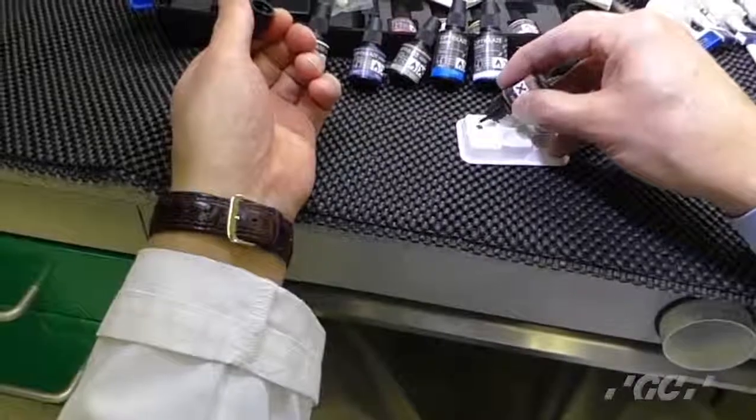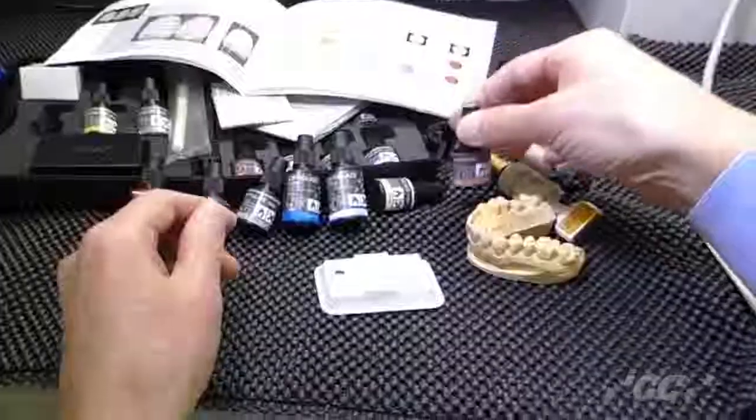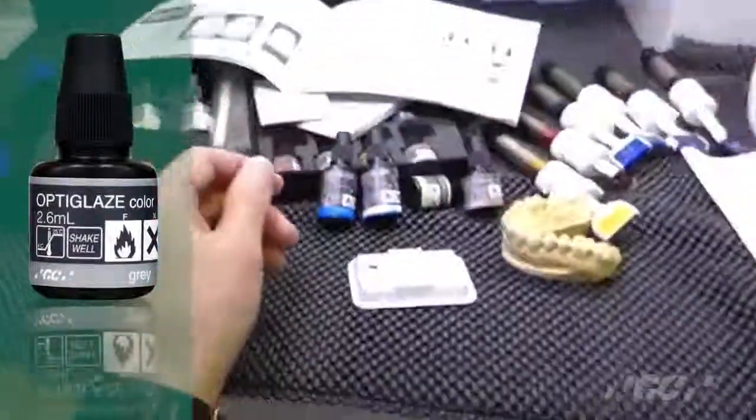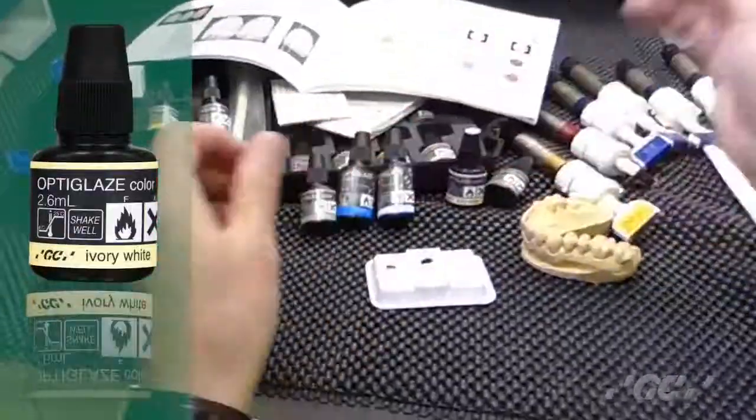Drop A shade, B shade, or C shade color first. Then if you want, there's a gray color. Shake well. Then ivory. Then blue.